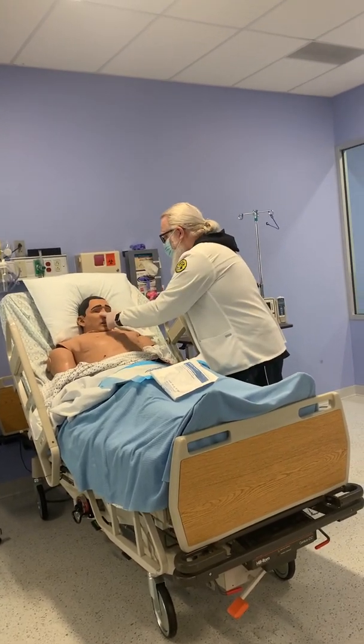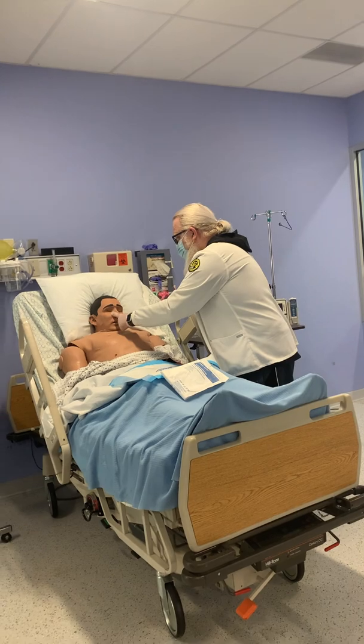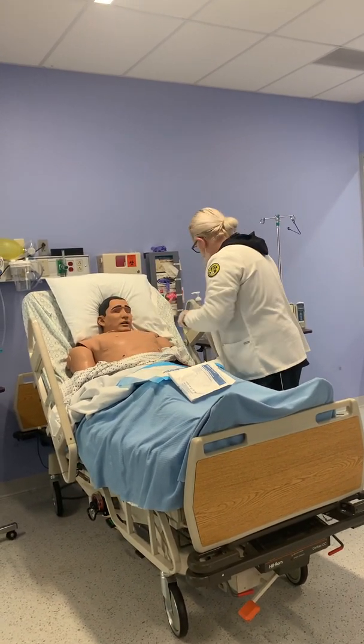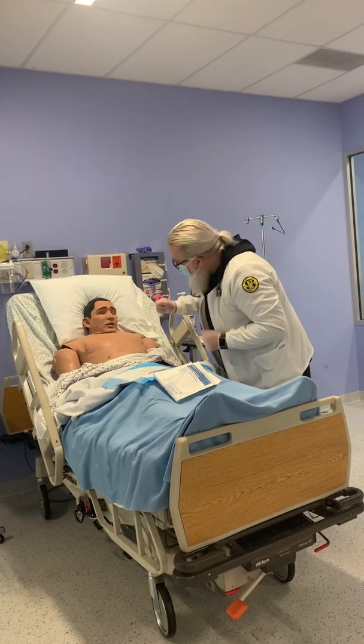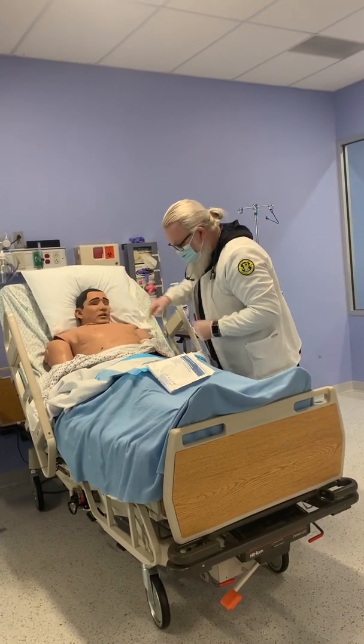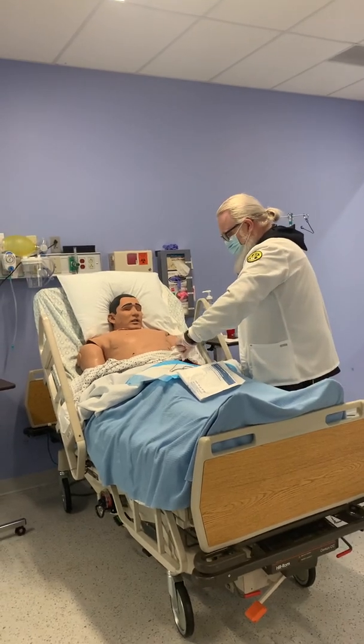Can you do me a favor? Take a deep breath, breathe out, good. Deep breath, breathe out, good. Did you feel any blockage or anything? No, I think we're clear. Okay, good. So we do have the NG tube.